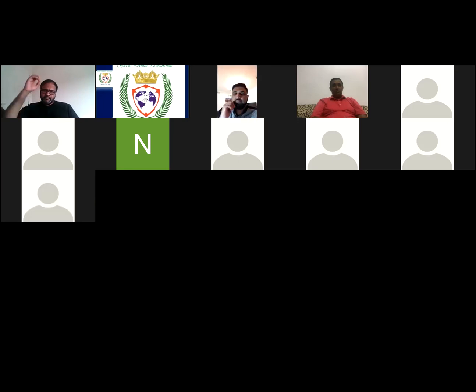Yeah, I was just coming back to the same question. Dr. Hilal answered about the zirconia implants, which is what is heard now. I happened to see an article. There's a new implant in town, which is the talk of the town now. Those implants have calcium silicate particles in them.